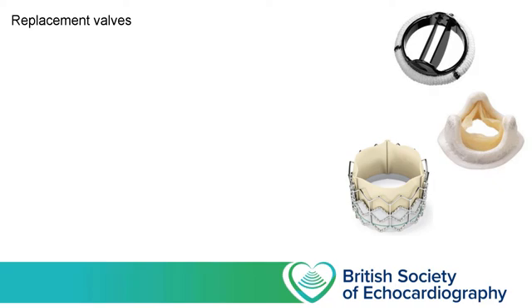For the level 1 sonographer, the key questions when facing a replacement heart valve are exactly the same questions you ask when thinking about a native valve. So does it open, does it allow blood through, and when it closes, is there any incompetence, any regurgitation? If there is regurgitation, does it occur through the valve, i.e. transvalvular, or around the sewing ring, i.e. paravalvular? Knowing how challenging it is, you should have a low threshold for seeking a second opinion.